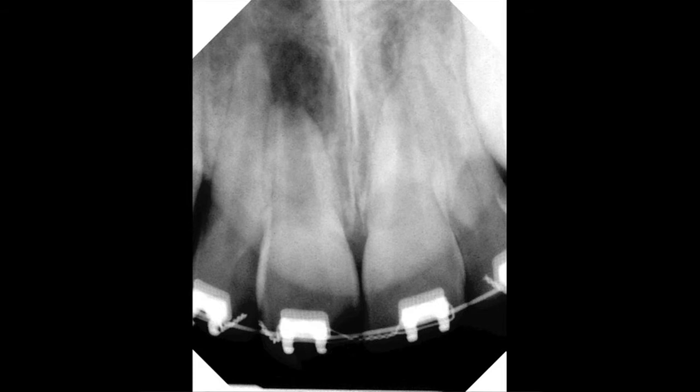This case is a maxillary central incisor with a necrotic pulp and a large apical lesion. The patient is also undergoing orthodontic treatment.